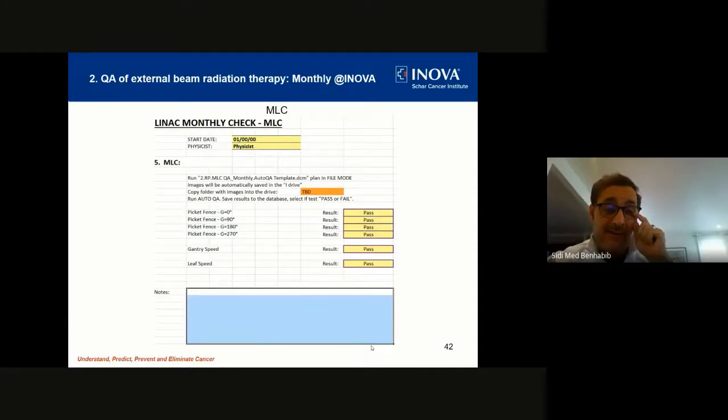MLCs, for some physicists, the recommendation is to do them on a weekly basis. So we do it on a weekly and a monthly basis as well. What we consider for a weekly is just an IMRT QA, and the monthly QA is more advanced.